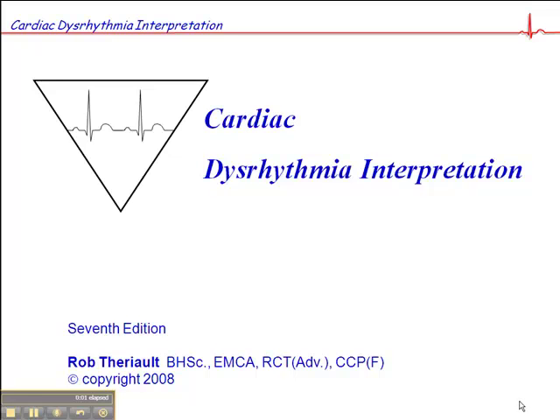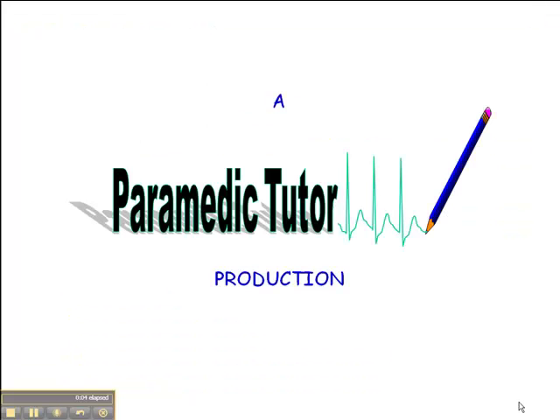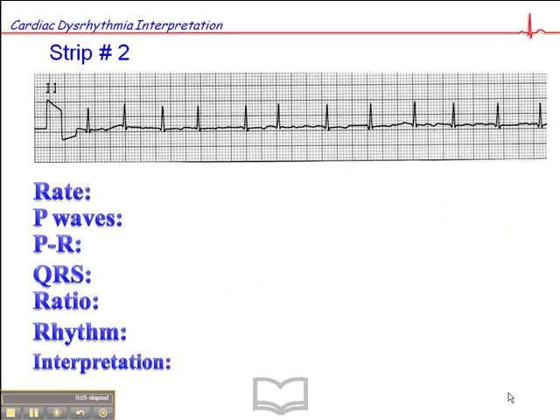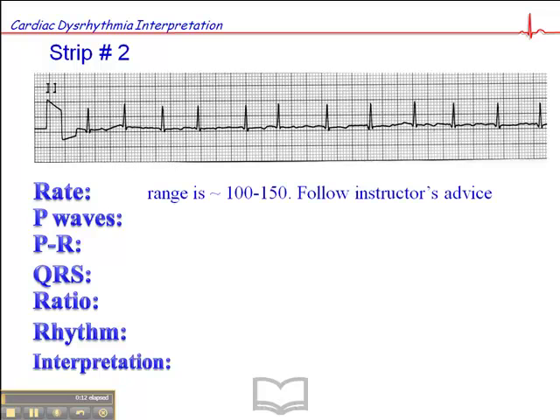This is ECG exercise number two, and this is also on page 85 of your workbook. Let's go through this step-by-step, starting with the rate. The rate really varies here, somewhere between 100 and 150.